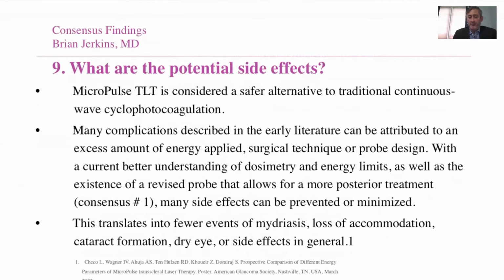I've changed the overall settings. I'm starting off with 2,500 milliwatts on every single patient. Very, very conscientious about doing the 20-second sweep velocity, which I think is extremely important. And now, as we'll see in the one case I'm about to present, sometimes bumping up a single parameter on a first case, even if I have a patient, we were talking about it earlier, I'm not even sure who said it, bumping up based upon a patient being extremely end stage. So the comfort level with this is that the current settings that we're recommending are extremely safe, and going a little bit higher than that is more than likely just perfectly fine and safe for the patient, even with good central vision.